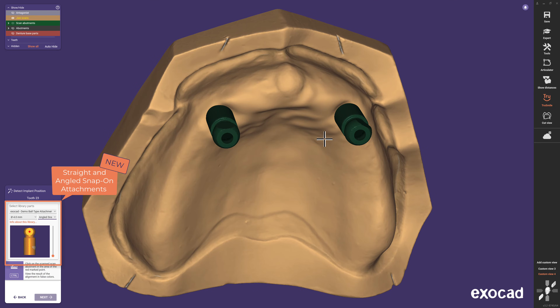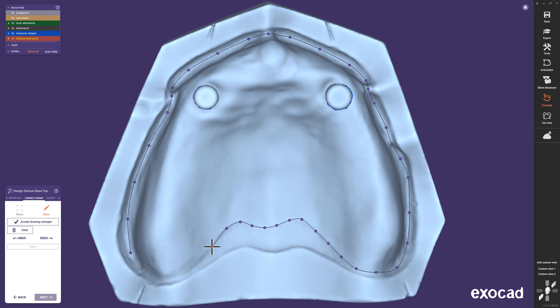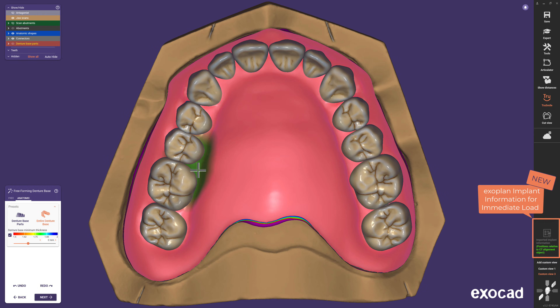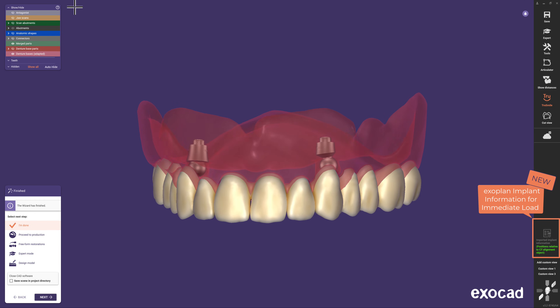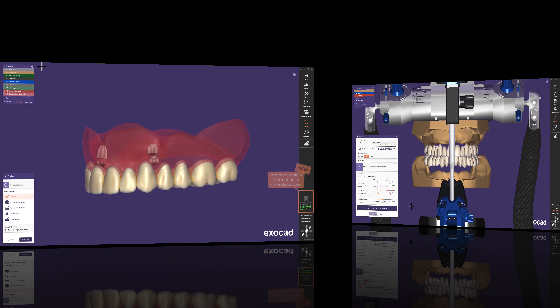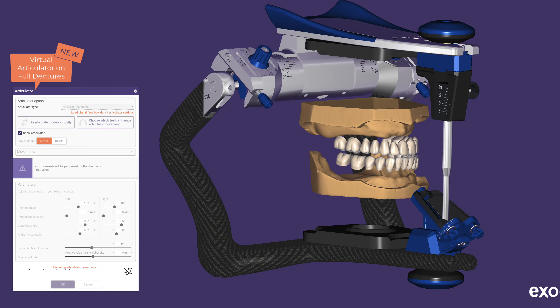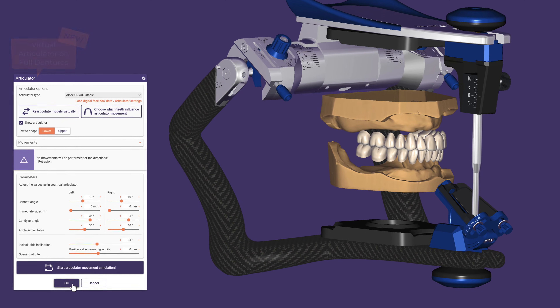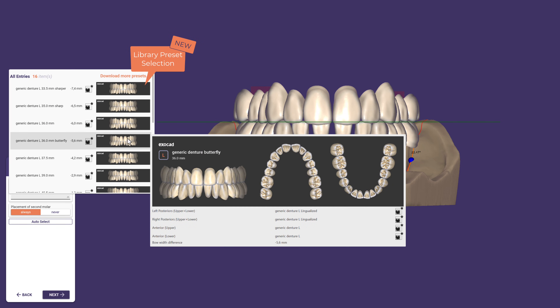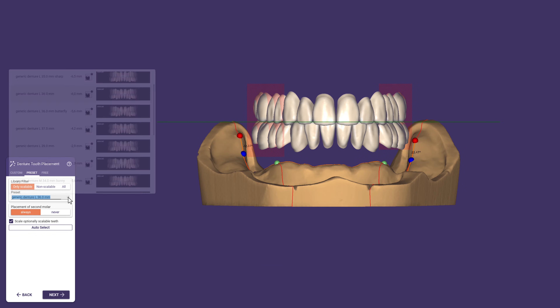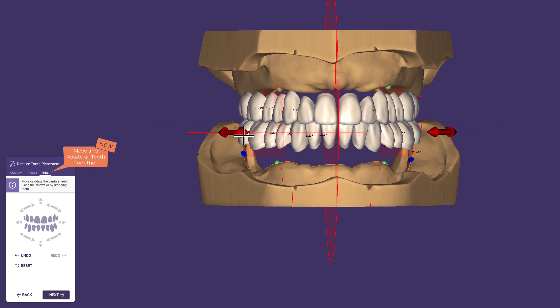A new guided workflow for overdentures on ball attachments is now available. Due to the seamless integration of Exoplan with DentalCAD, dentures on implants can also be manufactured preoperatively using the immediate loading process on locator attachments and compatible parts. We have updated the articulator model to make dynamic occlusion available on full dentures. We have also reworked the denture tooth placement, where the library preset selection shows a detailed preview of previously saved setups, and the free tab allows all teeth to be placed together more easily.